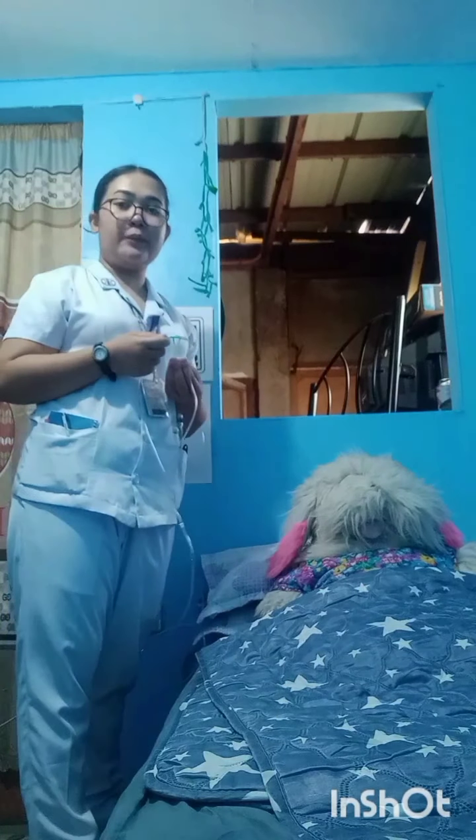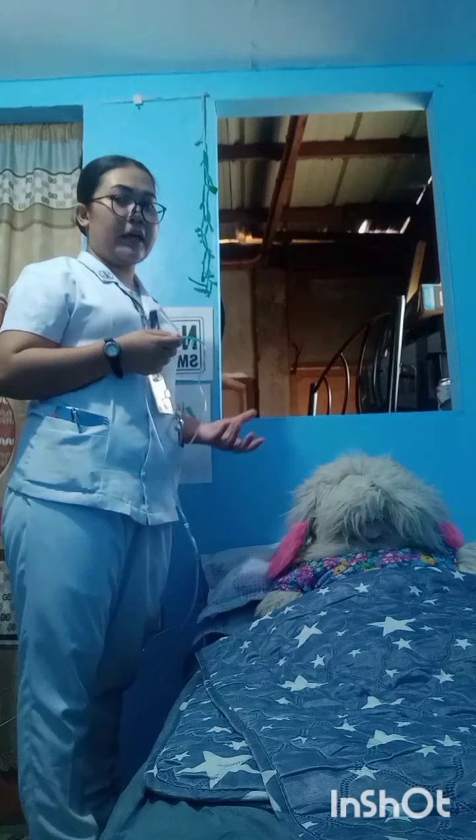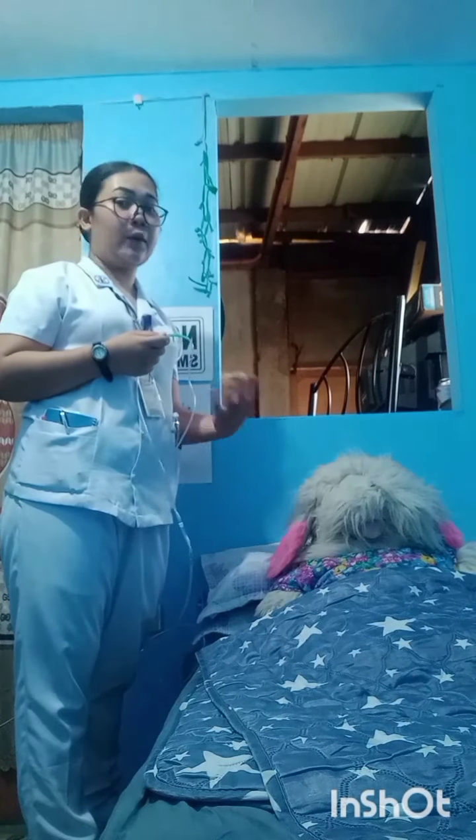Next step for that is we're going to set the oxygen at the flow rate ordered. Kasi hindi naman natin pwedeng magsiset tayo ng hindi ordered ng doctor. Anong mangyayari sa patient natin? Pwede siyang masobrahan ng oxygen or di kaya makulangan.